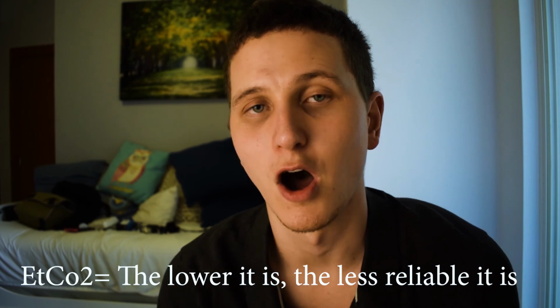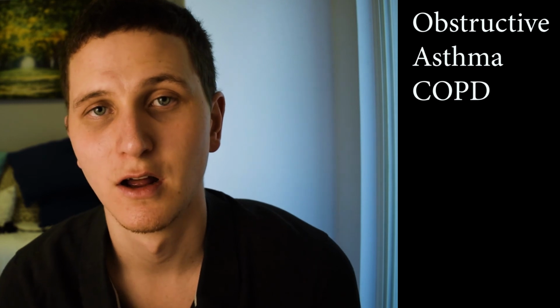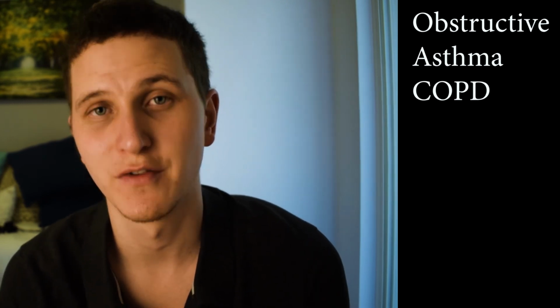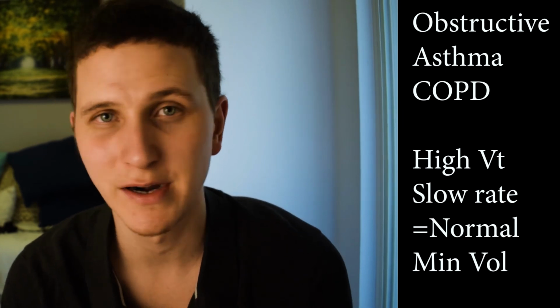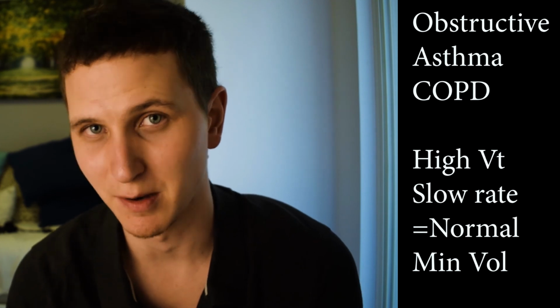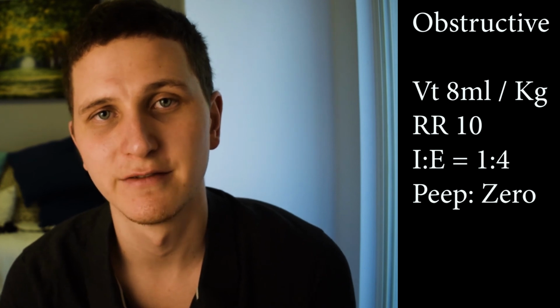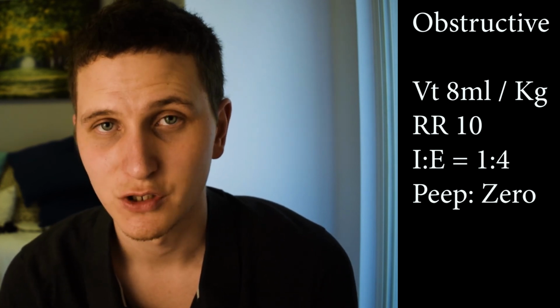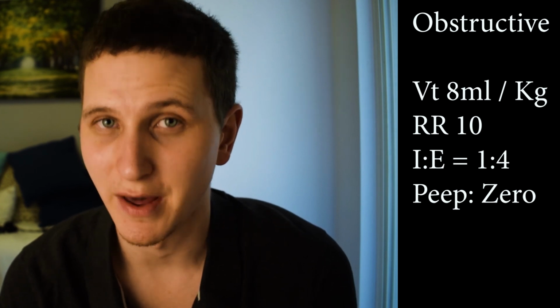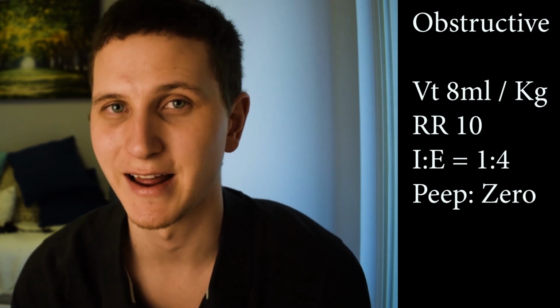When you have obstructive disease, like asthma, and there's air trapping, you want to have a much longer expiration. If we're breathing out slowly, it means we can't breathe quickly, which means to have the correct minute volume, we have to breathe a much bigger breath. So with an obstructive lung like asthma, you want to have 0 PEEP, so no positive end expiratory pressure. You're wanting to have a high tidal volume, so we're not going to be breathing fast, we're just taking big breaths. Because we're taking big breaths, we can breathe slower.